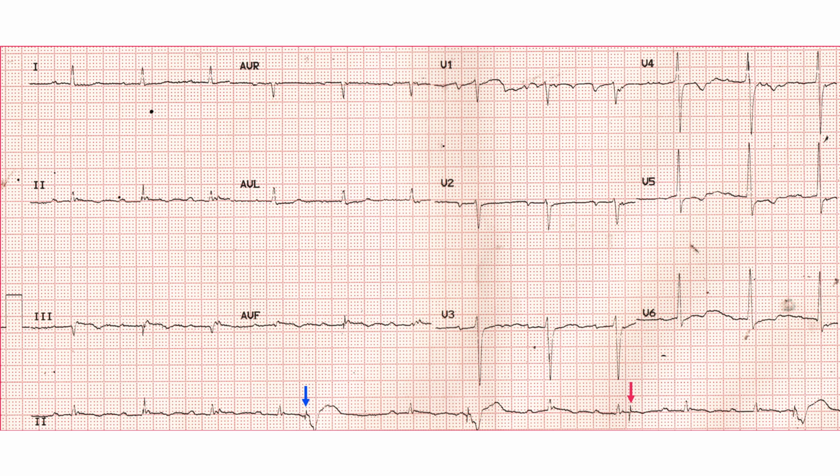Multiple pacemaker spikes or pacing artifacts are visible. The spike marked with the blue arrow has come a short while after the preceding QRS complex and has captured the ventricles, causing a wide QRS complex. The premature occurrence of the pacing spike would indicate a sensing failure of the pacemaker. The pacing artifact marked by the red arrow has occurred prematurely and has failed to capture the ventricles. The premature occurrence indicates sensing failure.